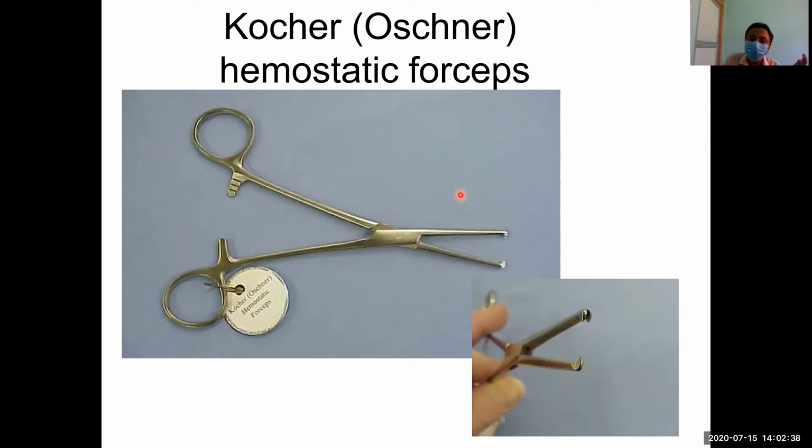So we can achieve hemostasis with a Spencer Wells hemostatic forceps also. We can achieve hemostasis with a Kocher's hemostatic forceps also. So why do we need an extra assembly of tooth and groove? Why do we need this extra sharp part?